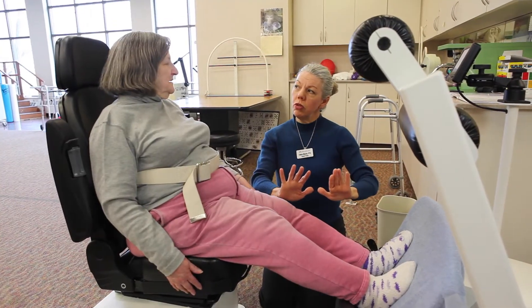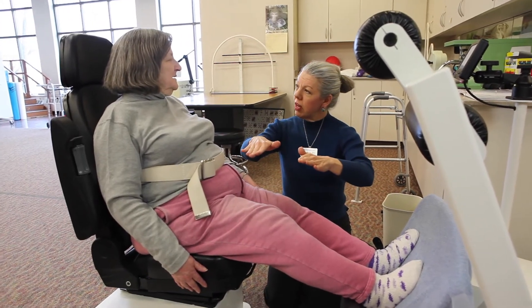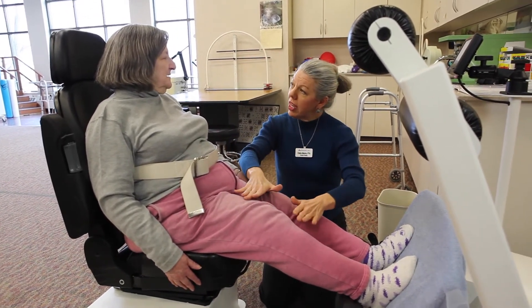So it gives a good challenge for the people that are looking for that, and for the lower level patients it gives them a nice light vibration. Both spectrums of our patients are able to benefit from the VibeTech One.